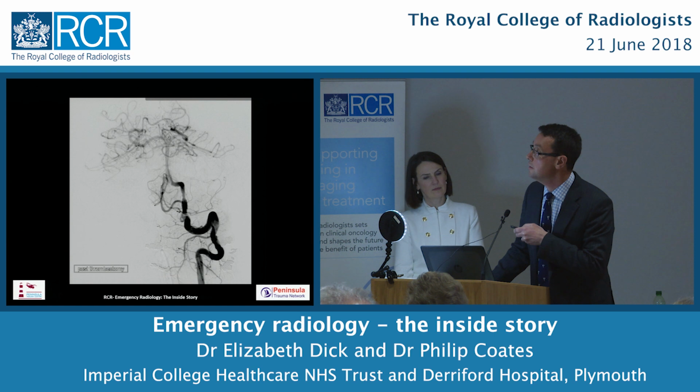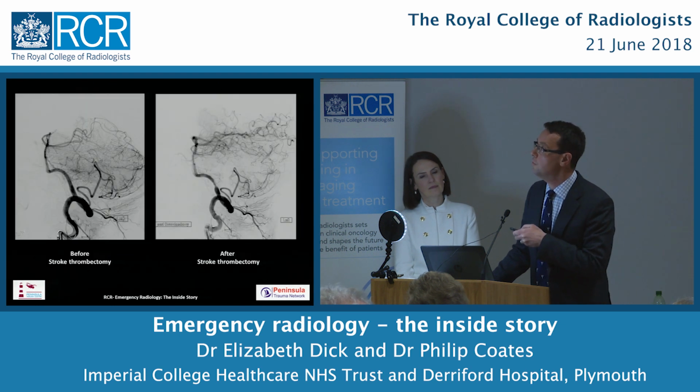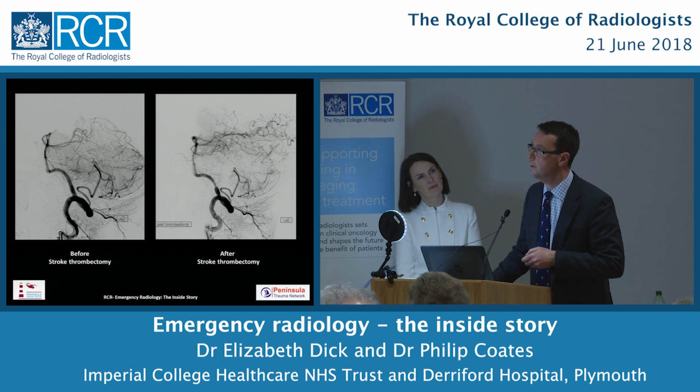So post-thrombectomy, you may appreciate we've got improved filling of these vessels here. There's some spasm of these vessels here, having had a catheter and guide wires placed up there, and that's not uncommon, that will go away. And this is the before and after imaging. So before the stroke thrombectomy, the vessels here have clot in them and they're not filling. Afterwards, we've cleared that, and all these vessels, this new territory here, is reperfusing, it's regaining its blood supply, and he did very well after that.